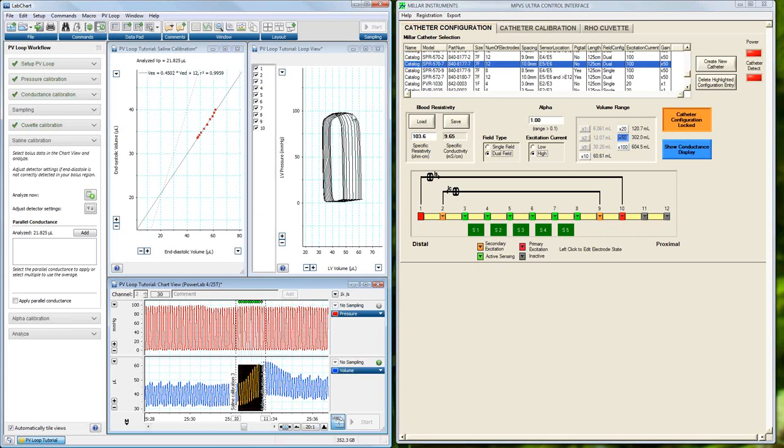So actually quite nice here. We have our nice volume increase at ISO pressure going across. So here's where we're going to determine, okay, this is responsible for the heart wall, and this is actual blood volume applying here. I can do multiples of these.